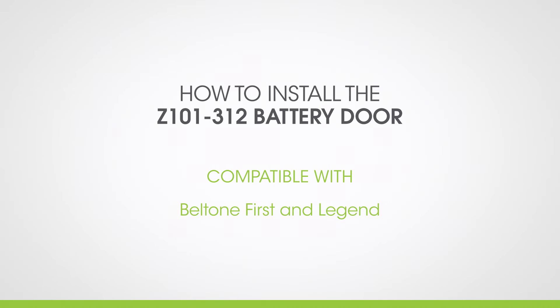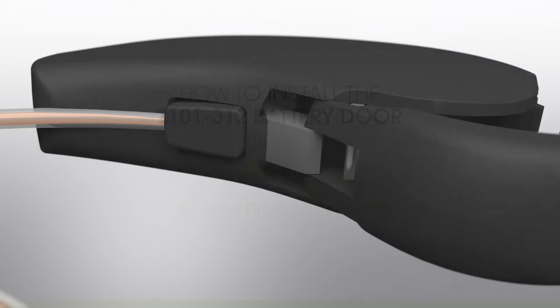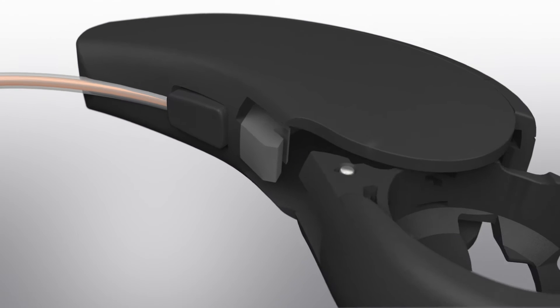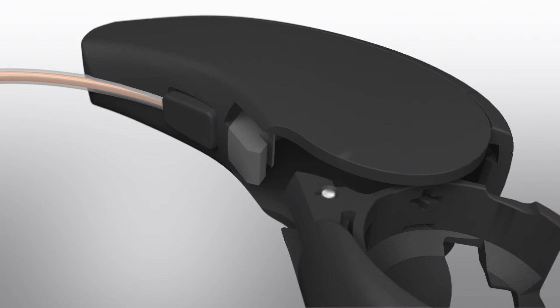This video is going to show you how easy it is to make many hearing aids rechargeable. Specifically, if your hearing aid simply requires you to pull the battery door off the body of the hearing aid, continue watching.